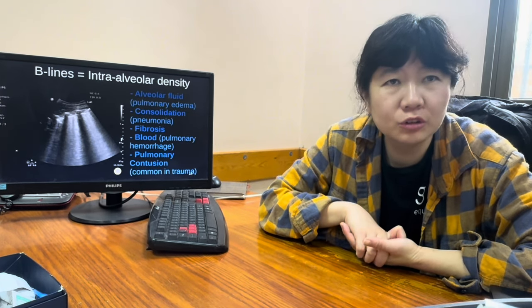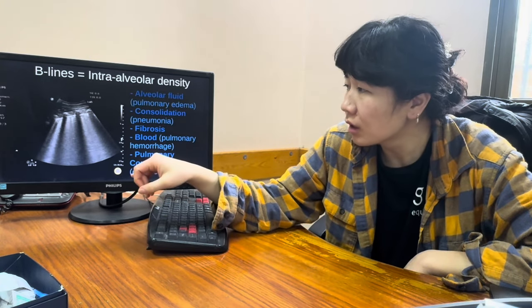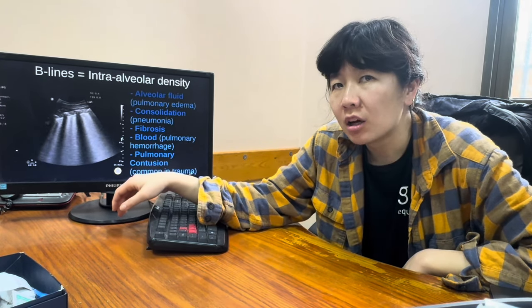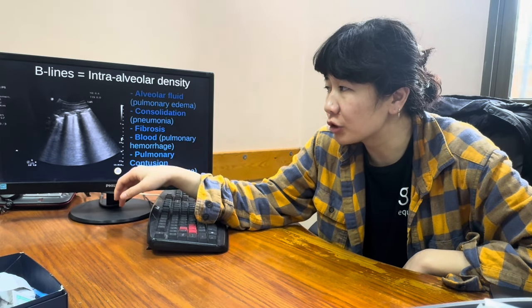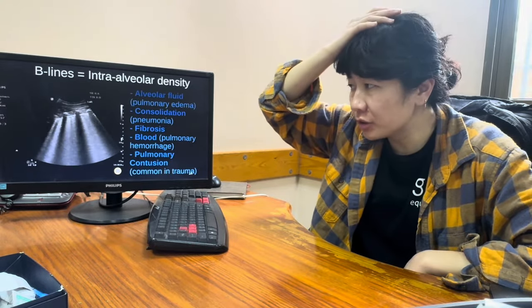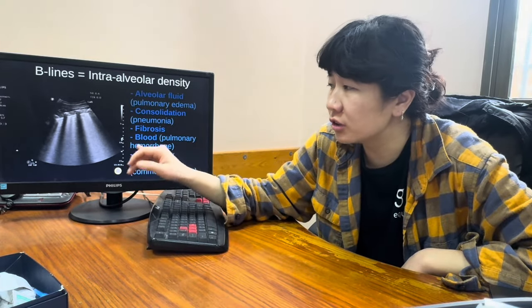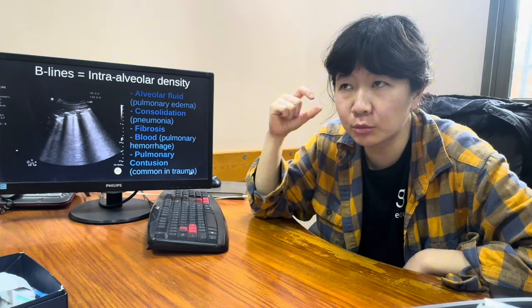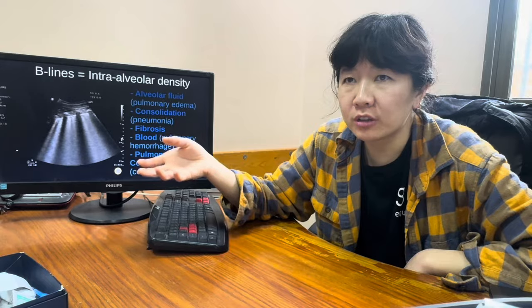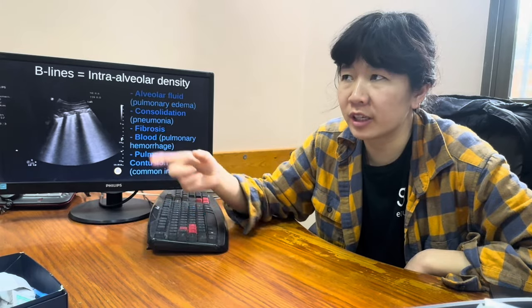Yes, perfect. So using serial ultrasounds helps to identify the treatment course and how the patient is doing. In the setting of trauma, you often will see it in pulmonary contusions. And actually, I found this really helpful during traumas, especially when I was working in an Indonesian hospital, because there's no CT available. You would see patients, when you listen with the stethoscope, who have decreased lung sounds after an explosive injury or something, and then the usual protocol is if you hear decreased lung sounds, just put in a chest tube. But if we had the ultrasound available, we just took a look at the handheld ultrasound.